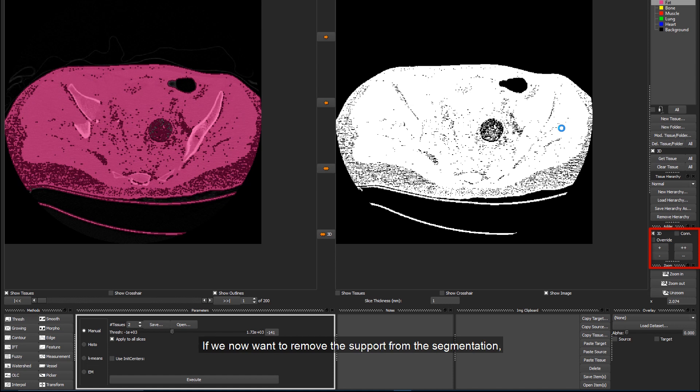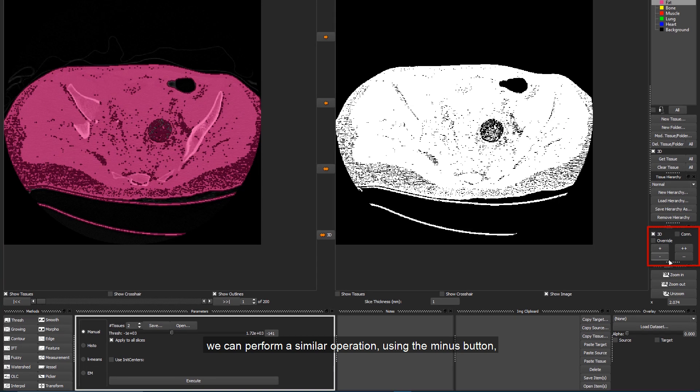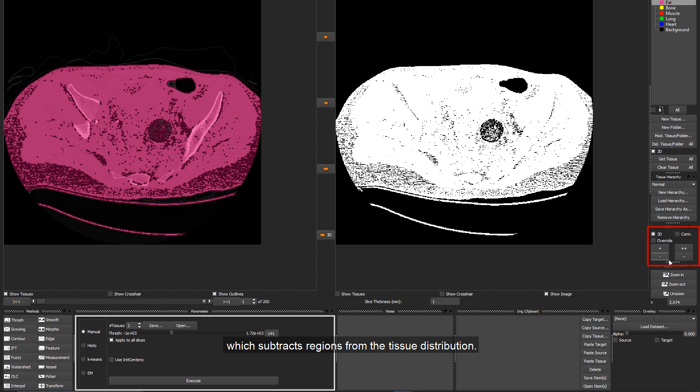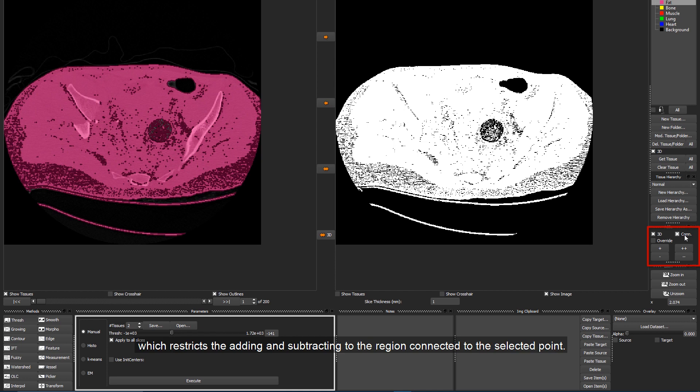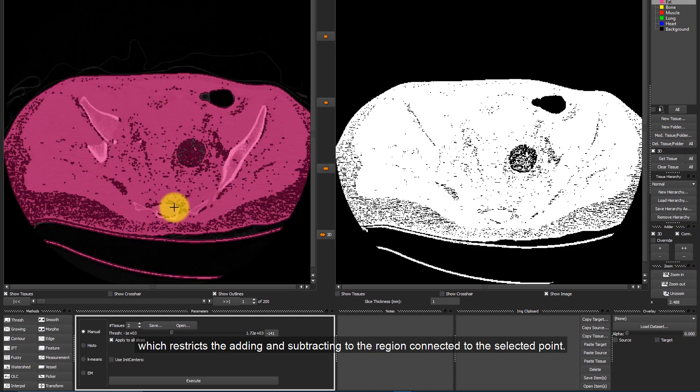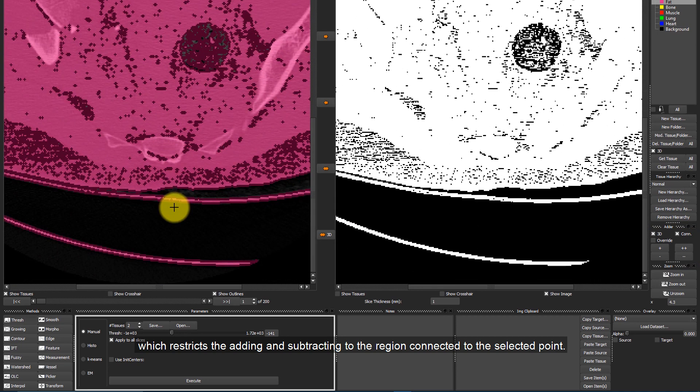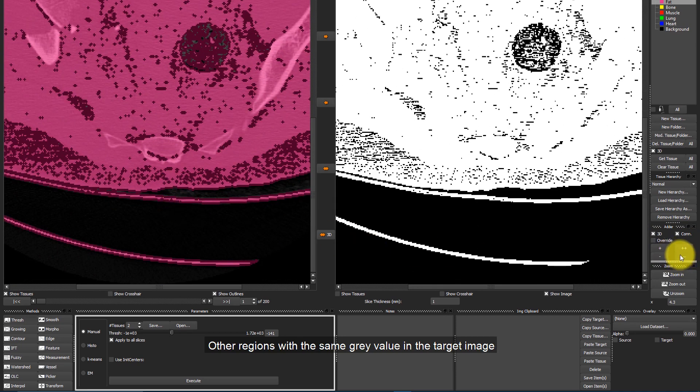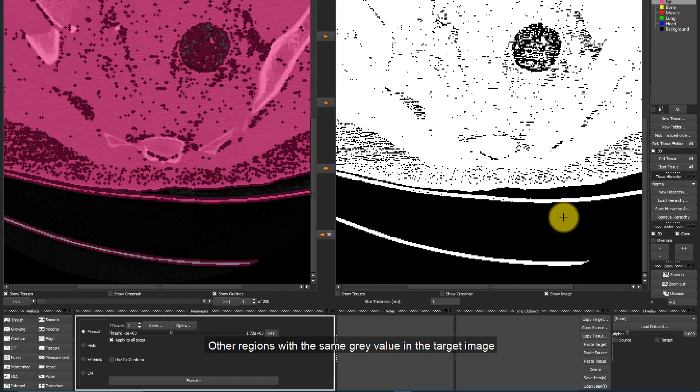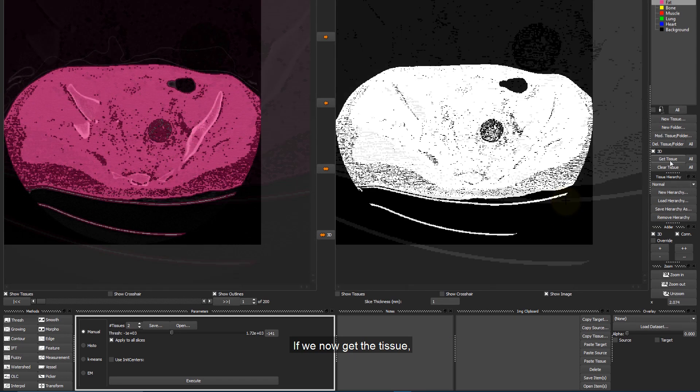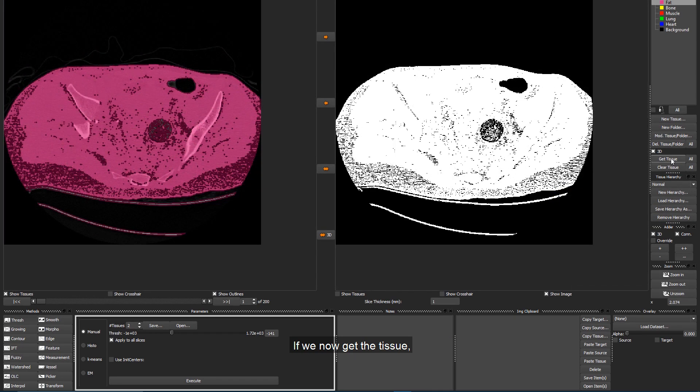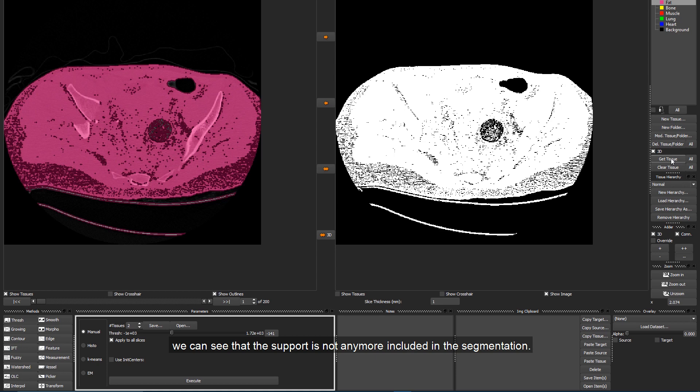If we now want to remove the support from the segmentation, we can perform a similar operation using the minus button, which subtracts regions from the tissue distribution. In this case, we will also enable the Connect option, which restricts the adding and subtracting to the regions connected to the selected point. Other regions with the same grey value in the target image will not be influenced by the operation. If we now get the tissue, we can see that the support is not anymore included in the segmentation.